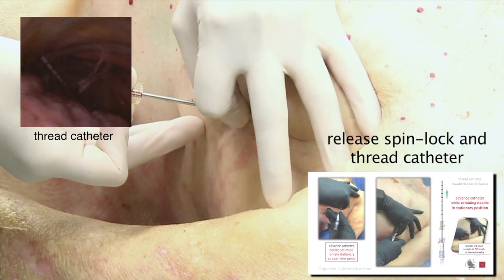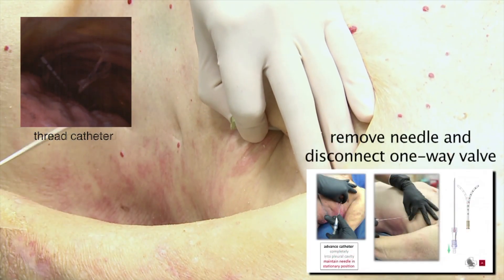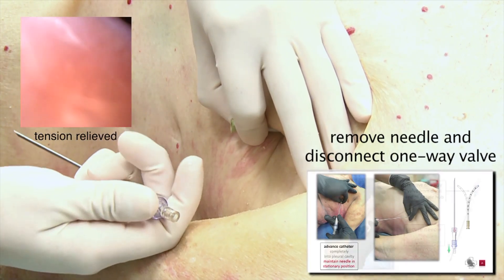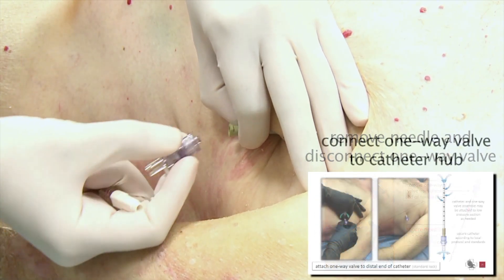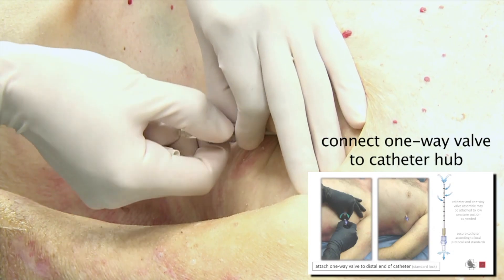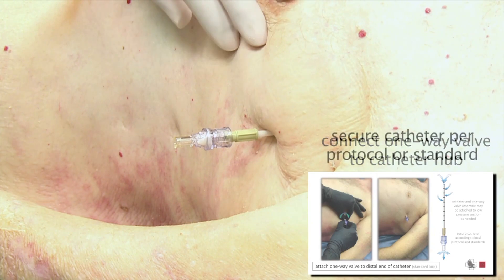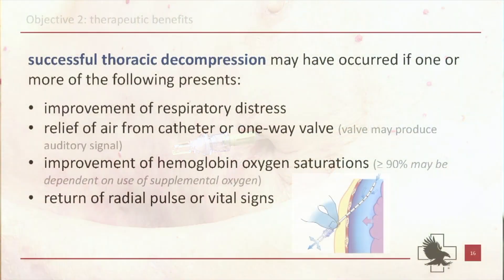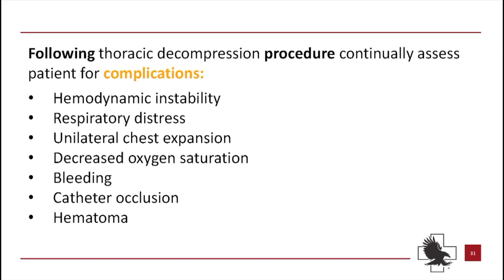Remove needle and disconnect one-way valve. Connect the one-way valve to the catheter hub. Secure catheter per protocol or standard. Monitor your patient for successful decompression or the development of any complications.